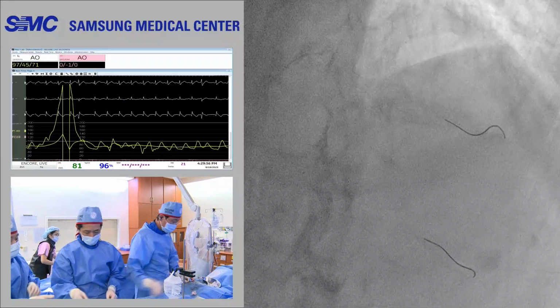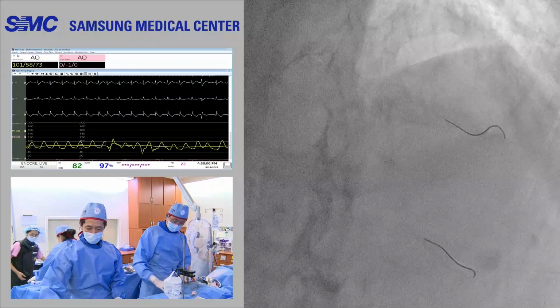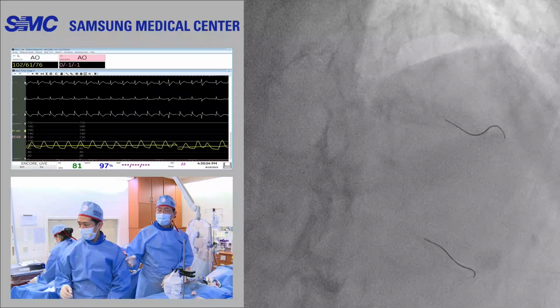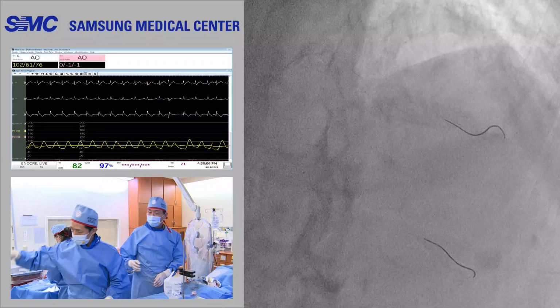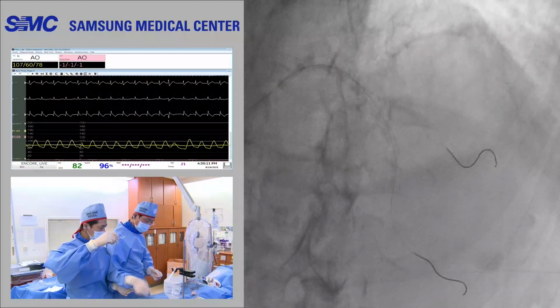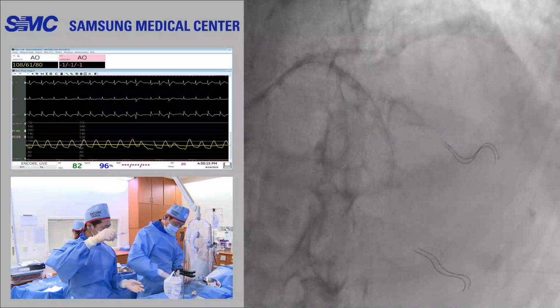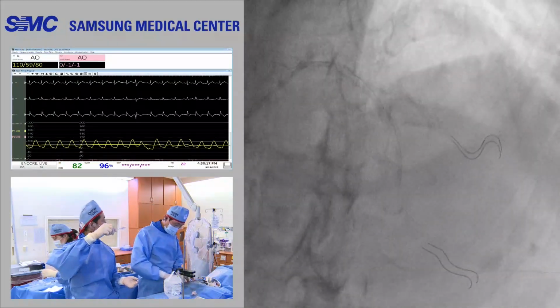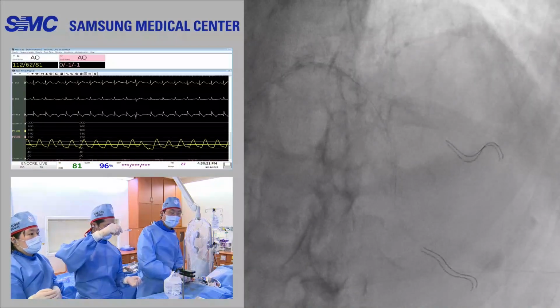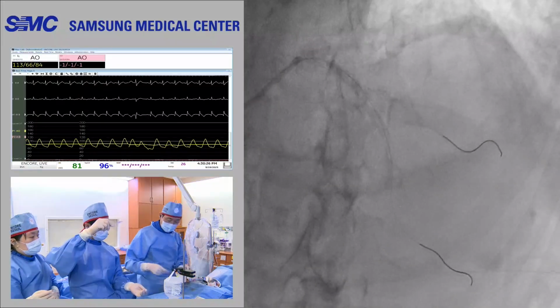CKD, marginal CKD, probably GFR is less than 30, because they quote it as a major criterion for HBR. Thus, I will acknowledge the concern about long time kidney hemodialysis. Actually, I don't have enough evidence to treat this lesion with the two DCB.